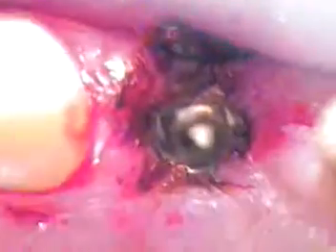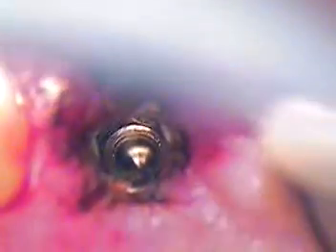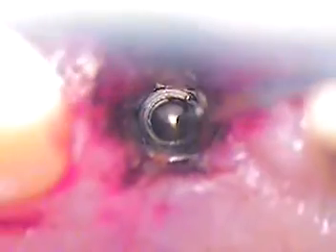Perfect. Now let's zoom in. Okay. I'm going to just take a small explorer because I just want to be sure there's nothing lying around. I'm not going to go in the threads. I just want to make sure there's nothing caked into the hex itself. I'm just going to gently, not to score it. Oh, see, there's some debris right there.